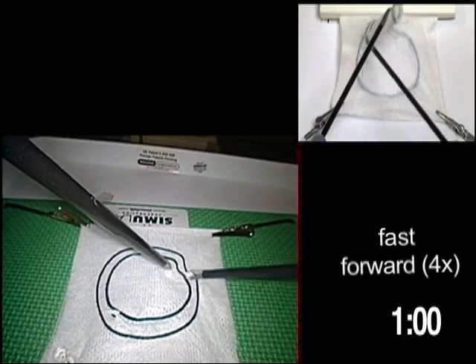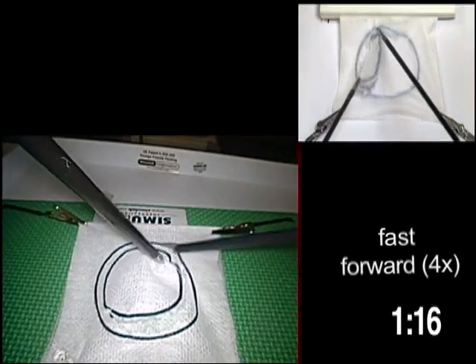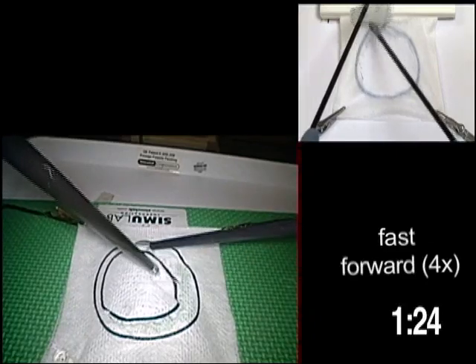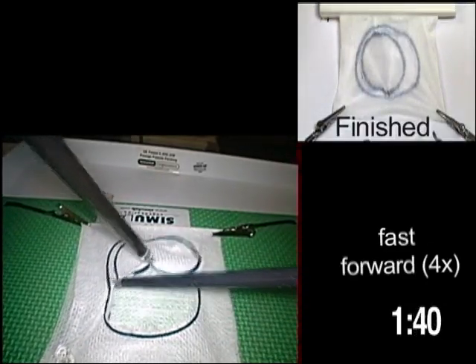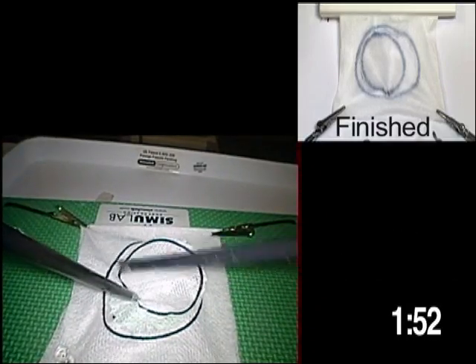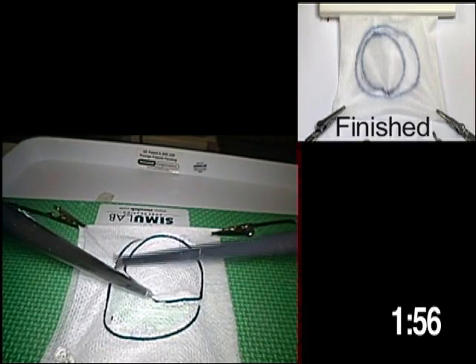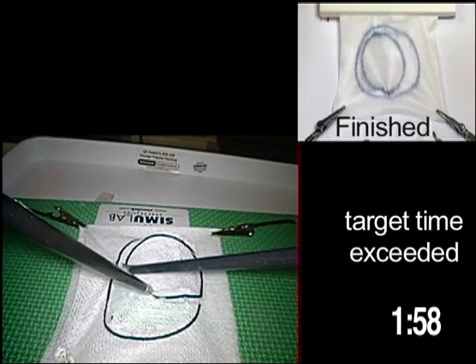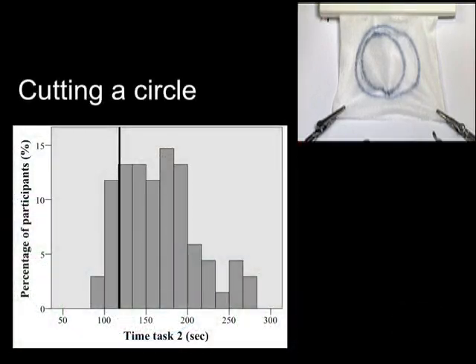Make sure you keep traction on the gauze when cutting. Time stops when the circle is loose. 85.7% of the participants exceeded the target time on this task.